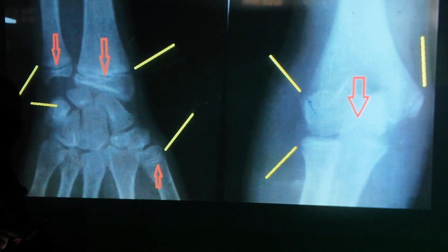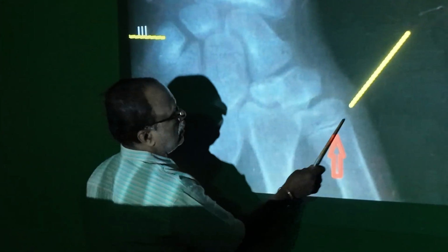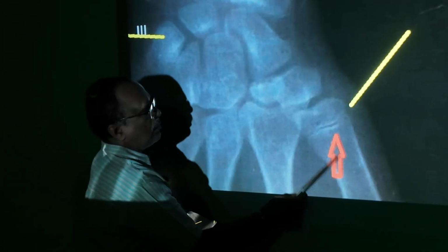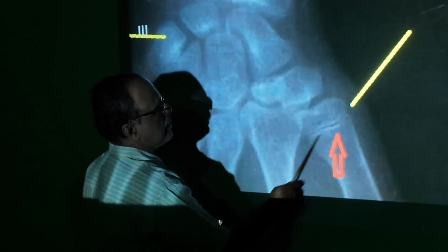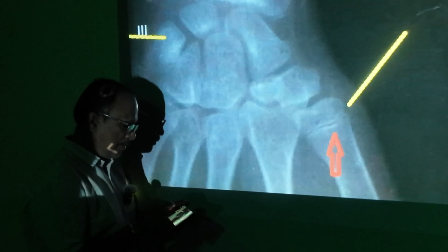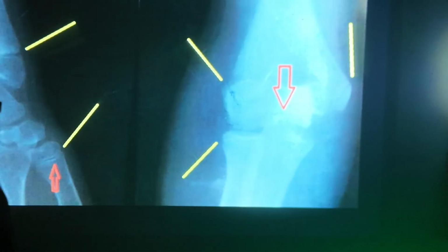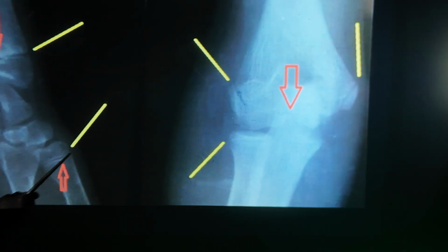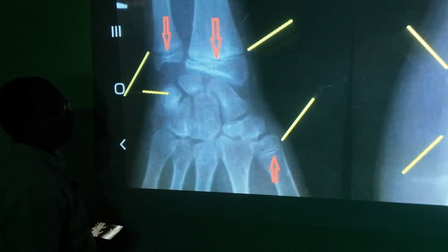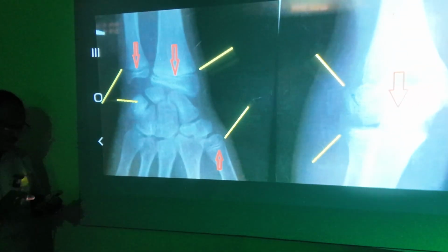You can narrow down the age. You can see first metacarpal bone, base of the first metacarpal bone unites by 15 years. It is not fused. That indicates age less than 15 years. Conjoint epiphysis is formed by 14. Base of the first metacarpal bone is not fused, less than 15. So you can say 12 to 15, or even 14 to 15 is also a correct answer.